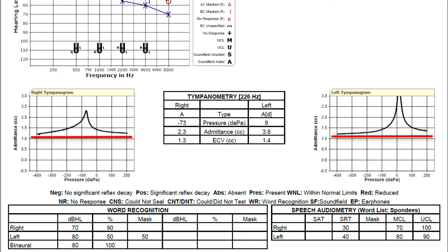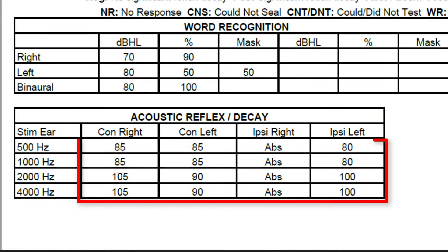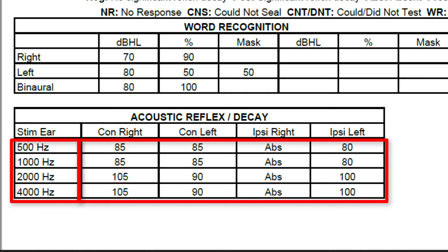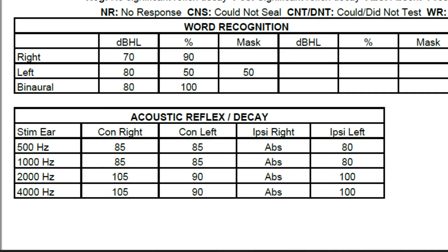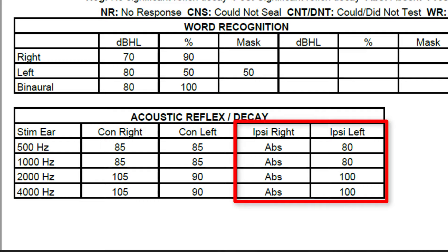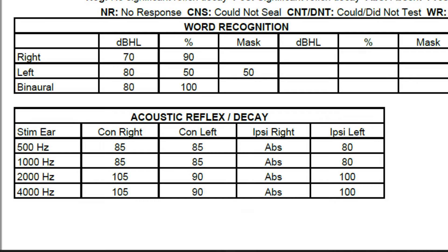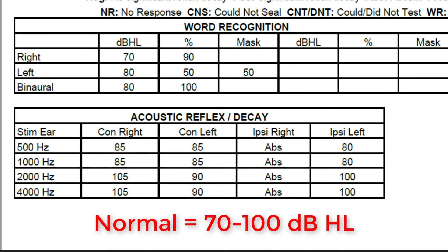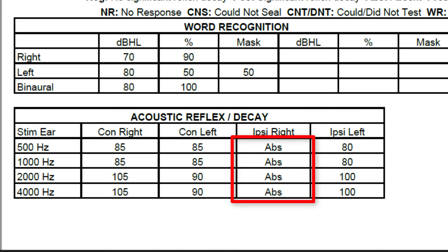If this line were to appear flat, it could possibly indicate that there's fluid behind your eardrum, or that you have a hole in your eardrum. The last thing that I want to talk about is acoustic reflex testing, or ARTs. ARTs can help provide insight as to how well your seventh and eighth cranial nerves are actually functioning. By sending a sound inside of your ear, we can measure the reflex of your stapedius muscle inside of your middle ear space. The decibel levels that were required to elicit the stapedial reflex at several different frequencies are recorded in this section. The reflexes in the same ear that the sound was presented is recorded under ipsi, and the reflexes recorded when sound was presented in the opposite ear is recorded under contra. We would expect to see levels roughly between 70 and 100 dB HL in most individuals. If you see absent thresholds, it could mean that the pathway of sound along a particular portion of your seventh or eighth cranial nerve is not functioning properly.